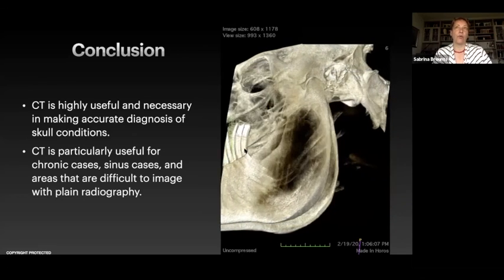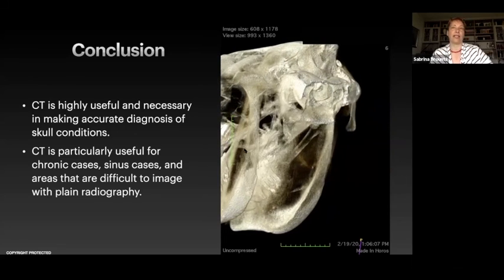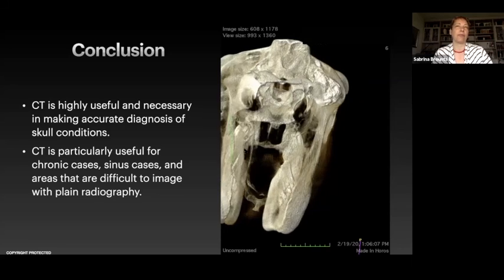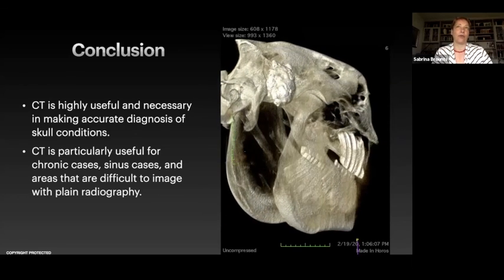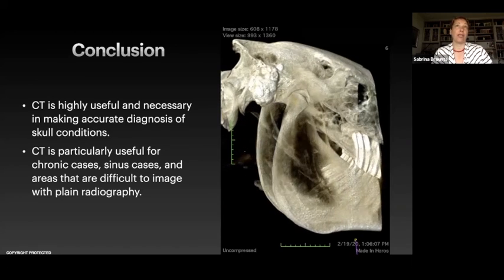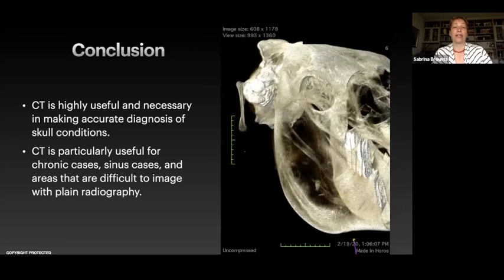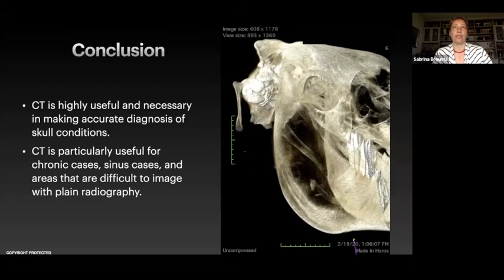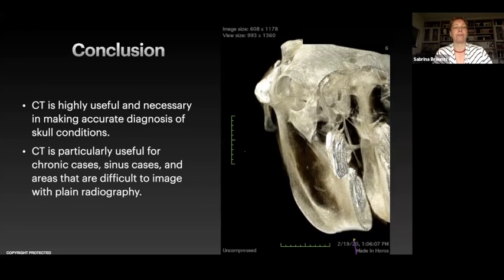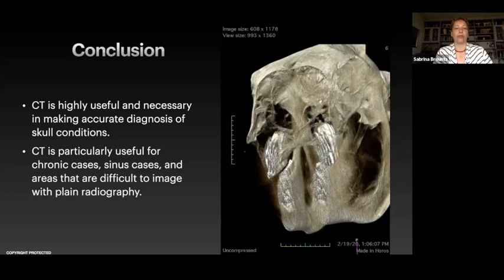So right now we pre-medicate them with acepromazine, depending on the size of the horse, anywhere from 10 to 15 milligrams IM. And then we use detomidine IV, and that depends on the horse. It could be anywhere from 3 to 8 milligrams, depending on the size and how cooperative the horse is, to actually get the CT scan done. And that works pretty well, and they're sedated enough to stand nice and still. And that's for heads as well as for limb CT standing that we can do with this machine.